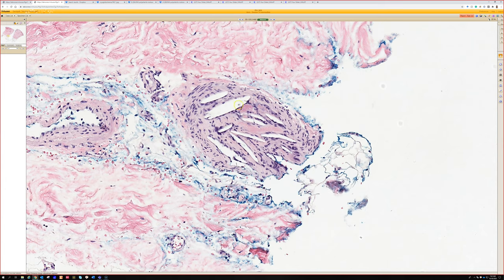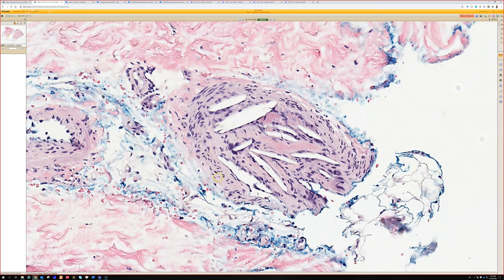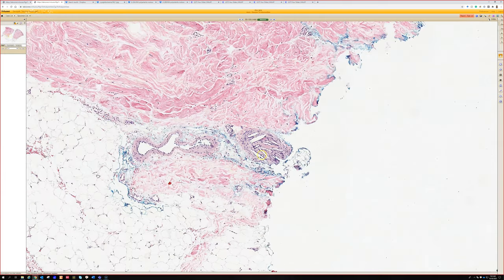These are cholesterol clefts — little spaces where cholesterol crystals were. They look quite similar to the cleft-like spaces that keratin fragments leave in granulomas, but this is inside a vessel, so it's not keratin. These are cholesterol crystals, and there's some fibrin in there. So this is a piece of atheroma from a person with atherosclerosis that's broken free in their aorta and went through the blood all the way out to the extremities and got stuck in a vessel. This is a nice example of a cholesterol embolus.